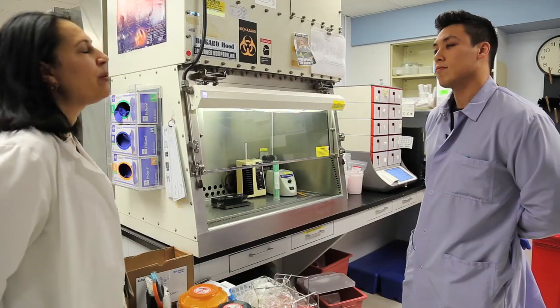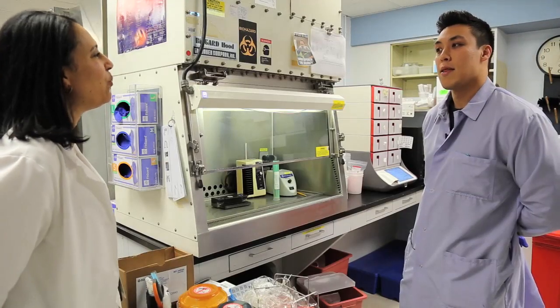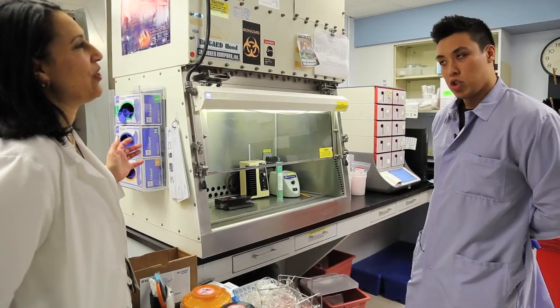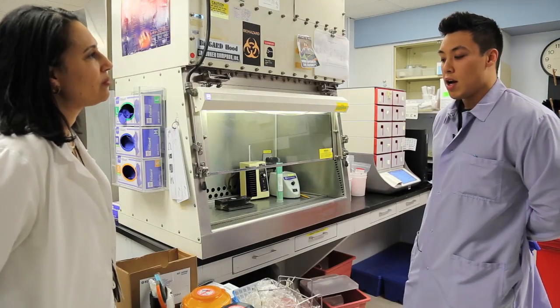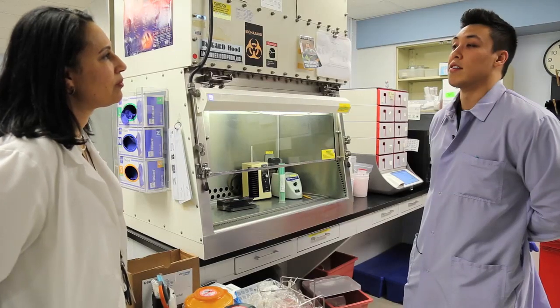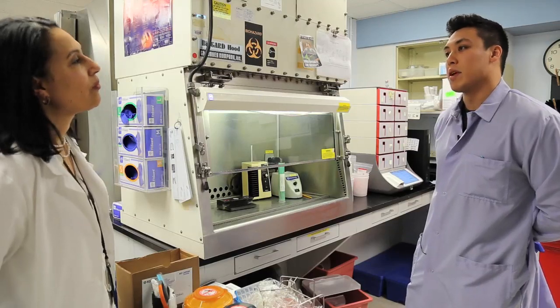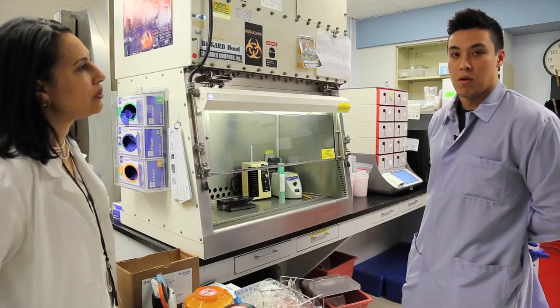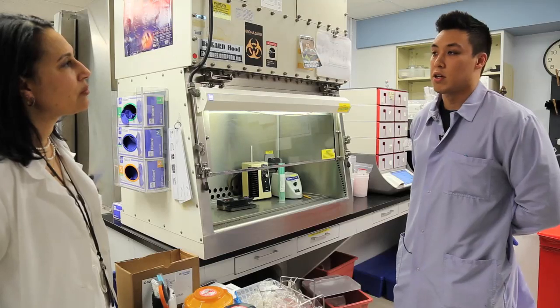And so you probably get a lot that are stat everything. We love that word. Yes. So how do you determine which ones to do first? Otherwise, the few that aren't stat might be sitting on the counter for a long time. Sure. We have a priority, and we use our best judgment in every case. However, stats usually come from emergency departments, cancer centers, anything that is inpatient first. Then we'll do some of the outpatient specimens. Like I said, we try not to batch them, but when we get a couple stats at the same time, we'll wait until we get them all in and run them all at one time to be as efficient as we can with our turnaround times.